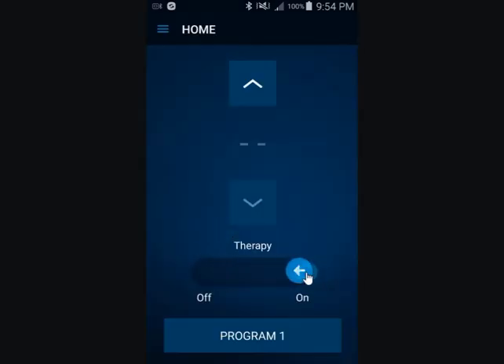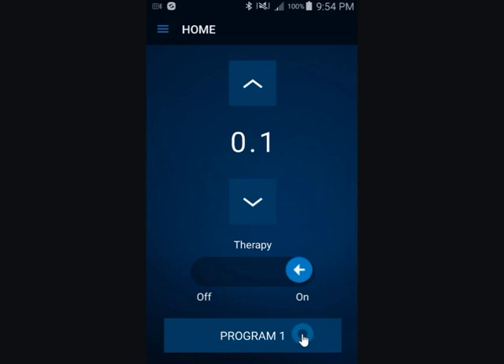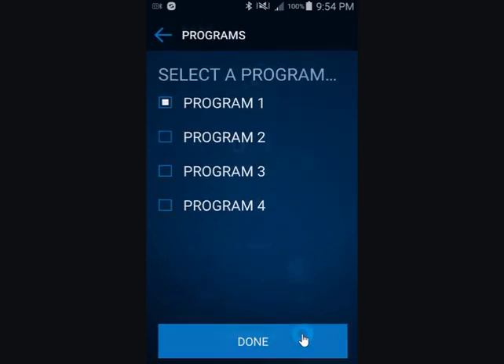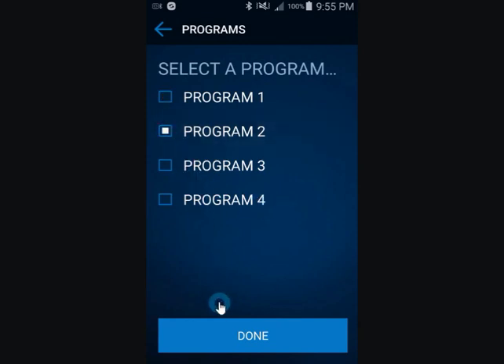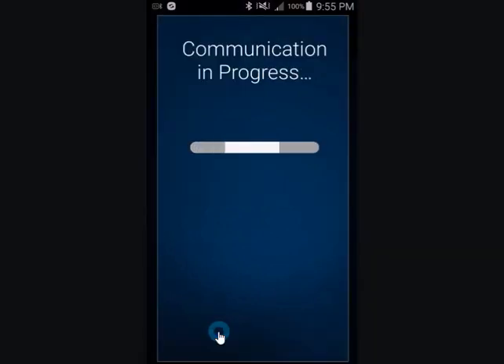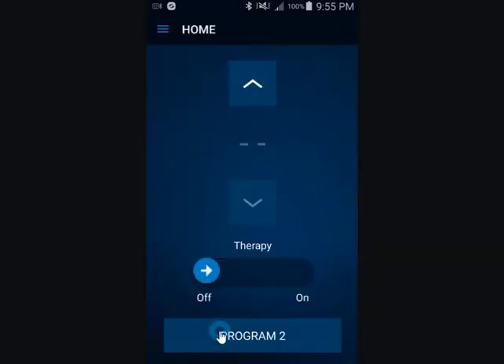A patient can change programs as directed by their clinician. To change programs, tap Program 1. The Select a Program screen appears. Tap the check box next to the desired program, then tap Done. Once a new program is selected, increase the stimulation to a comfortable level.